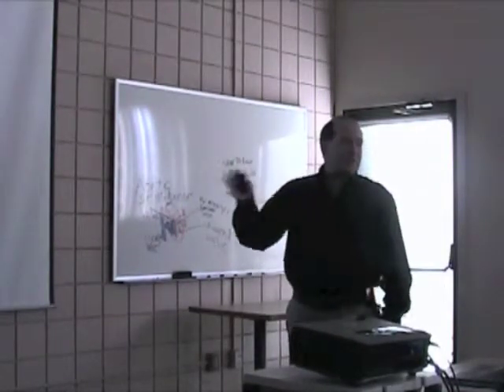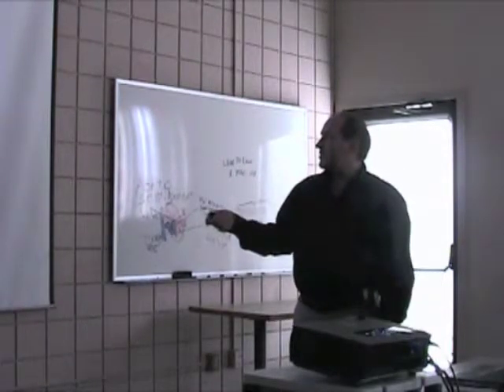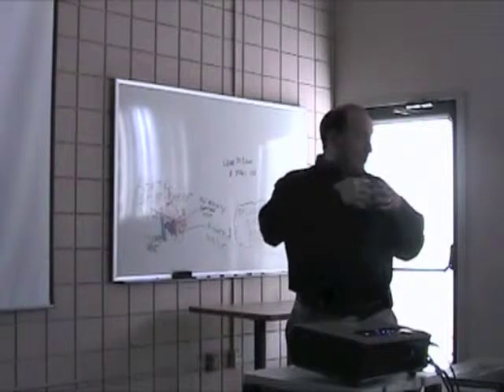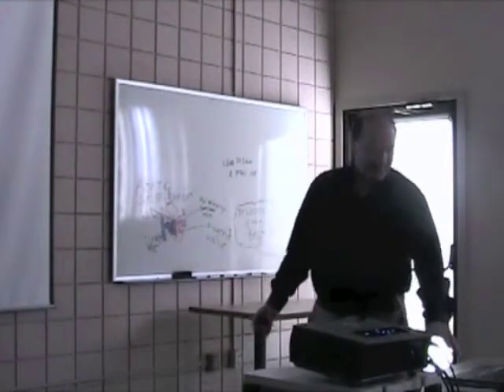So it opens partially. It's more efficient than the original valves, but it doesn't open completely. So when you have any mechanical valve in place, it's not as efficient as the human valve that was there that opens completely. There's still some resistance to flow.